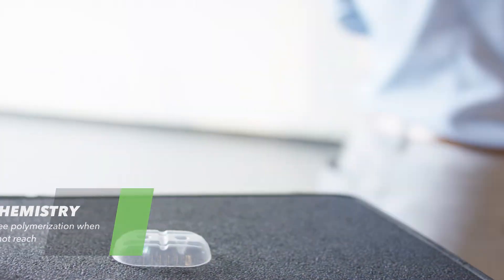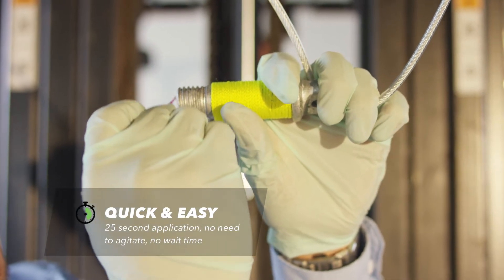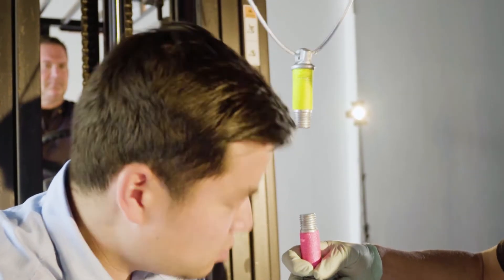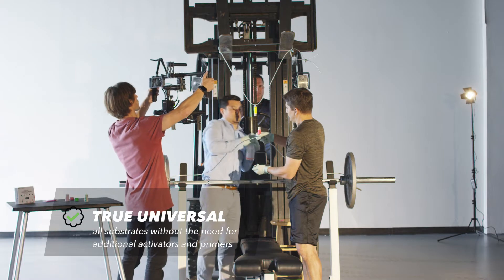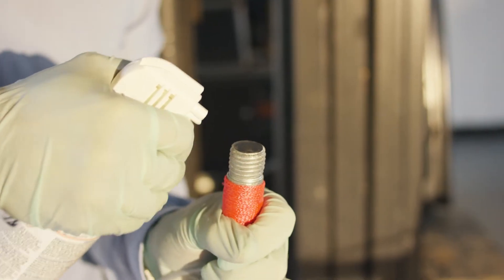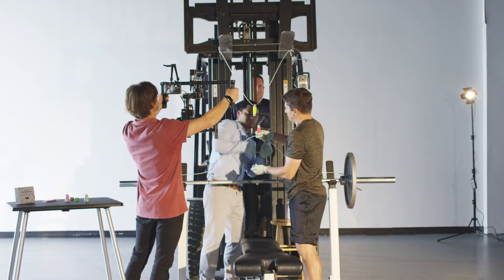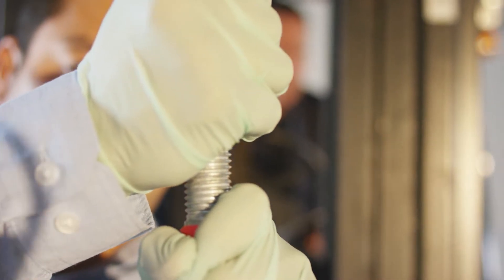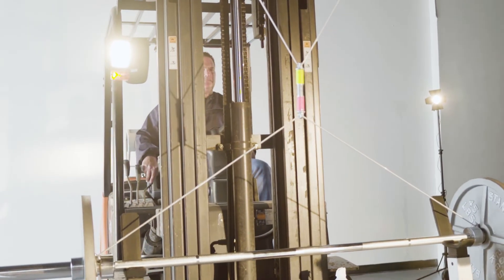It's also able to bond to any substrate — ceramic, acrylic, metal, composite — without the need for additional primers and activators. Apply weak, then medium air. This should be your one stop shop where it eases.